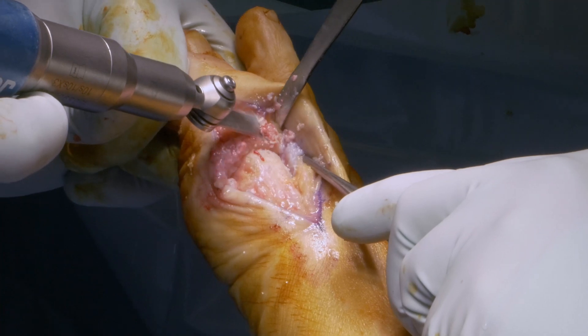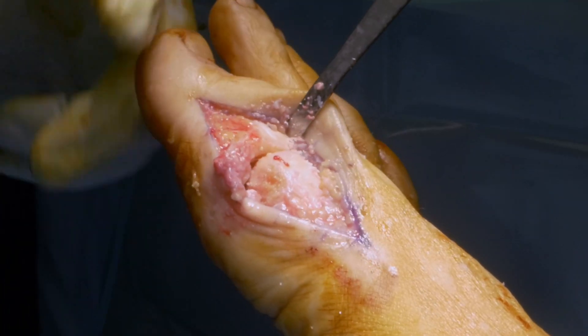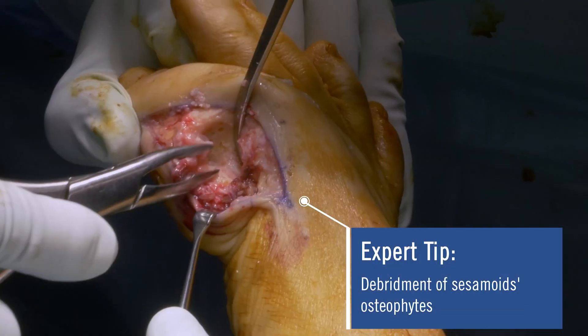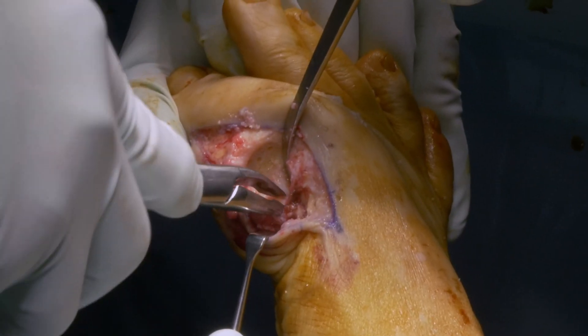The remaining bone is removed with a saw on the dorsal side for ideal plate placement. The debridement of the sesamoid osteophytes needs to be checked, and if necessary should be carefully removed.